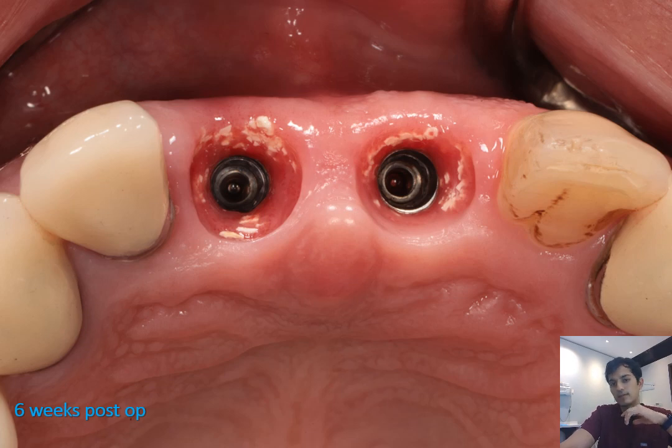Now, just going off topic slightly and talking in particular about the dual zone approach, when you take off the healing abutment or restoration and you see these bone particles embedded in the soft tissue, it really keeps those tissues firm around the implant. Even if you keep the healing abutment off for a few minutes, there's minimal, if any, collapse of those tissues, and it allows for your impression to capture that emergence profile without any changes, without the need to duplicate the profile of that healing abutment or custom provisional. So that's why it works very well for me with immediate implant cases.